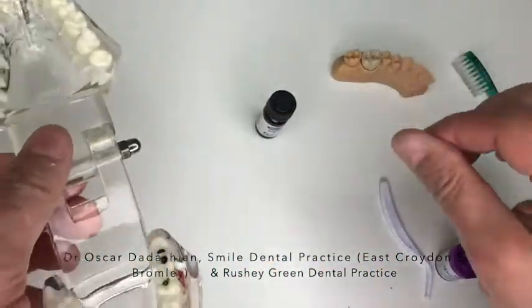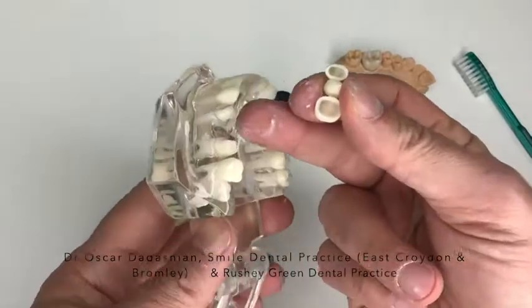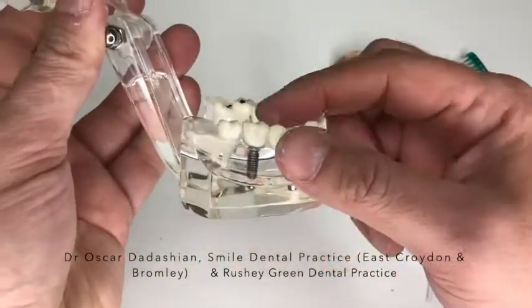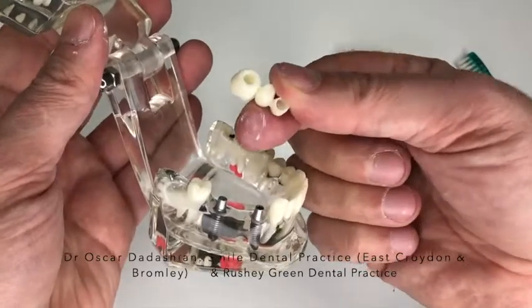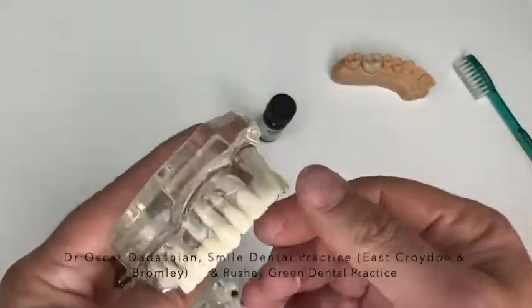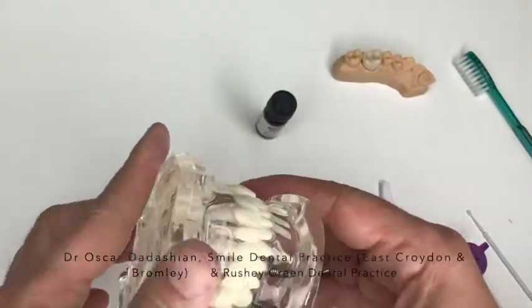You can do exactly the same thing if it is a bridge that has come out. You do the same thing, you clean the adjacent teeth, you fill this up and you put it back in. If it's a bridge on implants, same thing there. You clean everything up inside here and on the abutments, put a little bit of material in there and bite together. And same thing if it's a single crown on an implant. You do exactly the same sort of thing to put it back in.